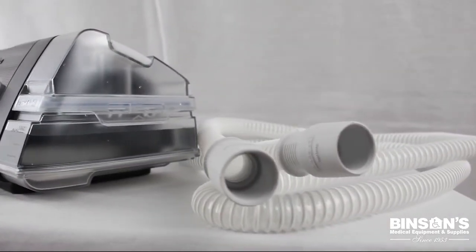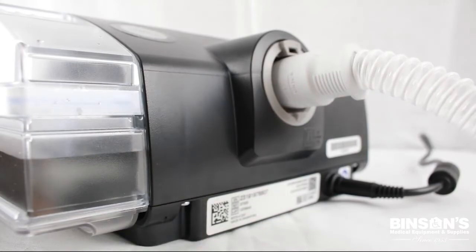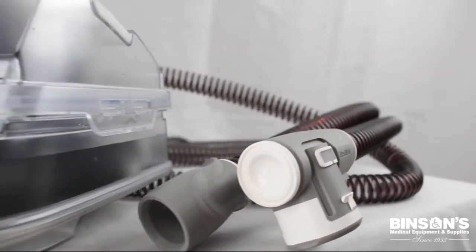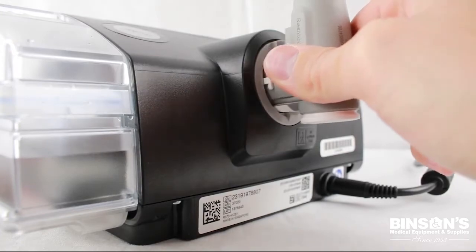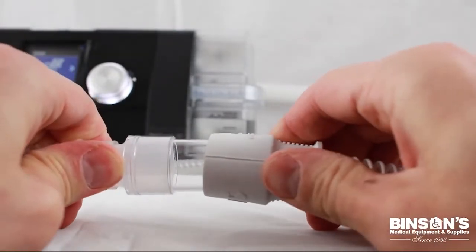Next, connect the air tubing. If your machine came with a SlimLine tube, simply connect it to the back of the device. If it came with a ClimateLine air heated tube, hold it by the cuff, line it up with the connector port, and push it until it clicks into place. Finally, attach your mask to the other end of the tubing.